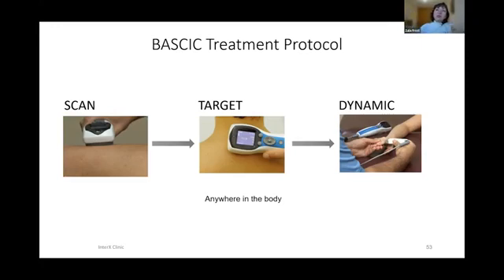So there was the 55, 38, 83. So now I'm going to 55 point, again, 4-directional sliding technique. And lastly, I'm gonna do on 38, yeah? And then you just can do all the areas smooth with your dynamic, and that your treatment is complete.